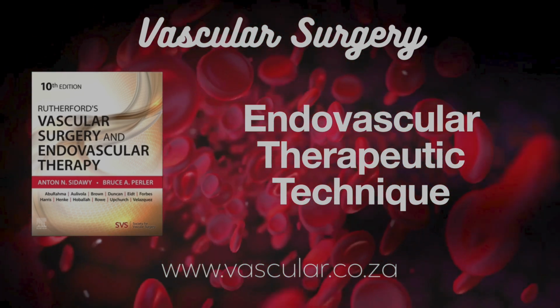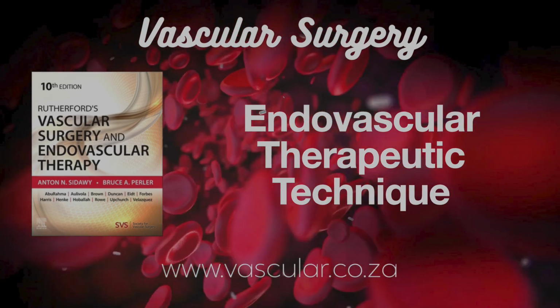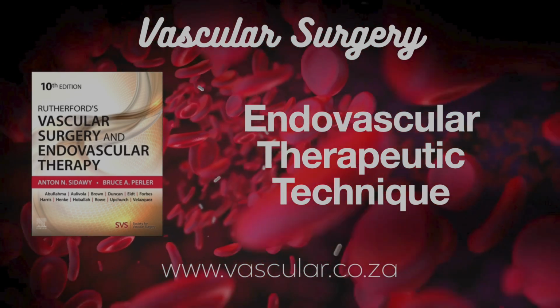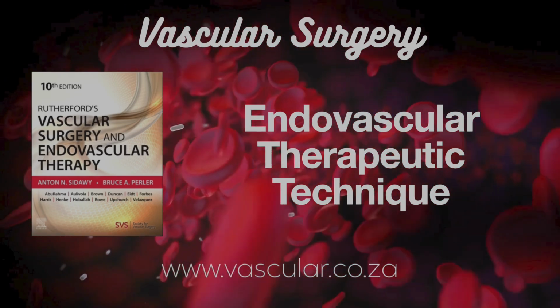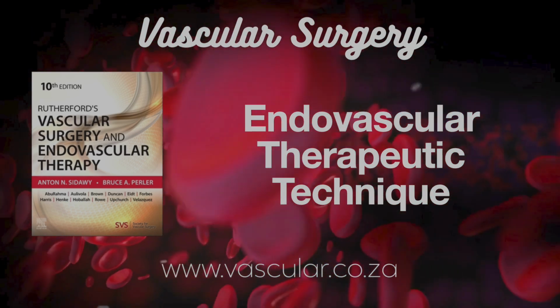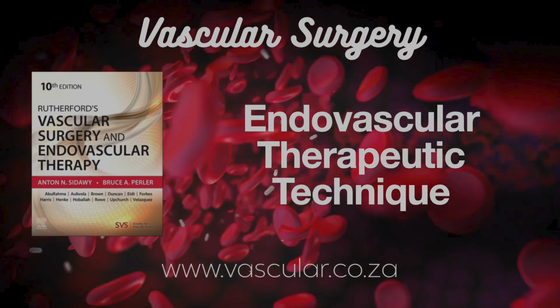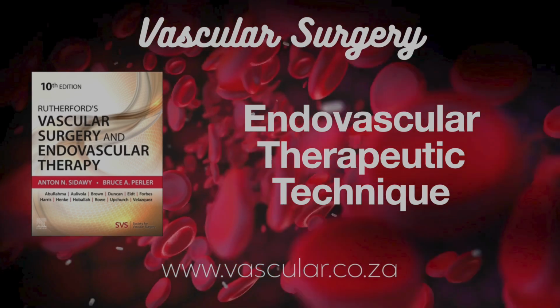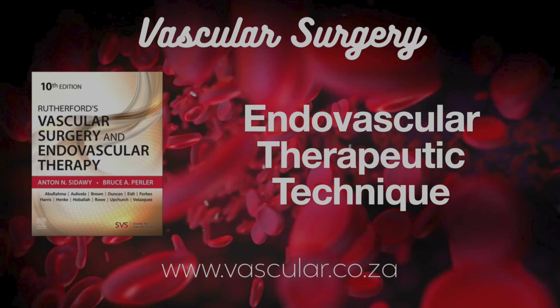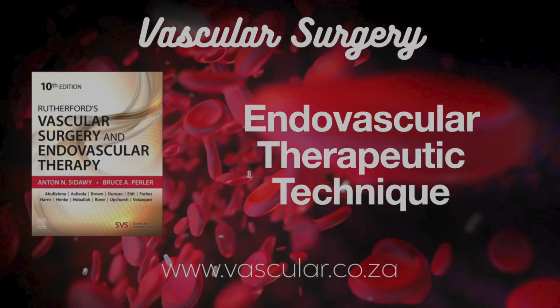Devices for true lumen crossing. Things like the Crosser catheter, Frontrunner XP, they often have stiff, tapered tips, maybe some microdissection capability. Success rates reported around 83–88%, with low complications in experienced hands. And for subintimal crossing with re-entry, devices like Outback LTD, Pioneer, and TruePath, they have steerable tips and features to help punch back into the true lumen distal to the blockage. Similar success and low complication rates reported. One potential risk with some re-entry devices like Outback is extending the dissection plane significantly. The choice depends heavily on the CTO's characteristics: length, calcium, side branches.